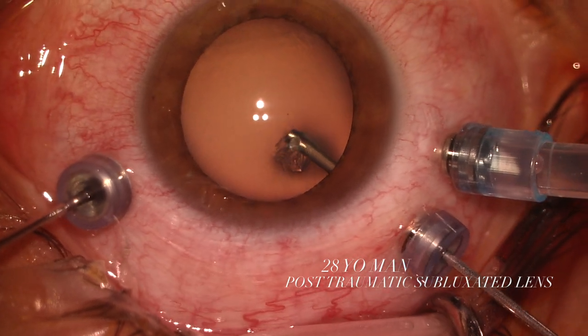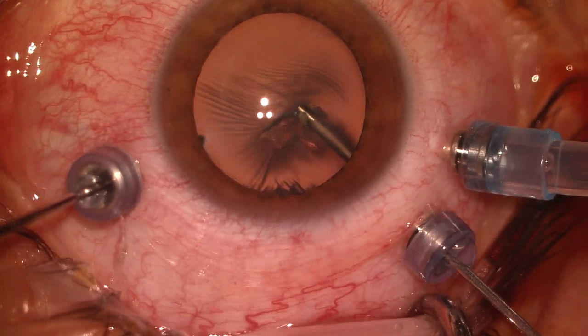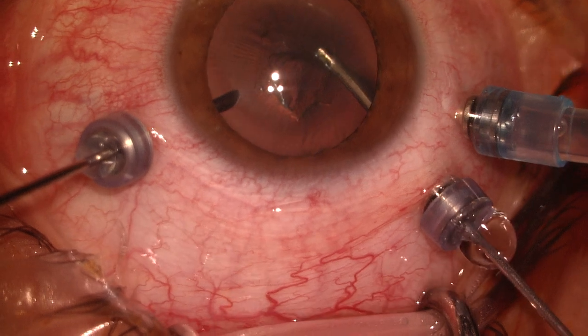Presenting the case of a 28-year-old patient with post-traumatic lens subluxation and a large zonular dialysis, which makes it impossible to implant in the sulcus.